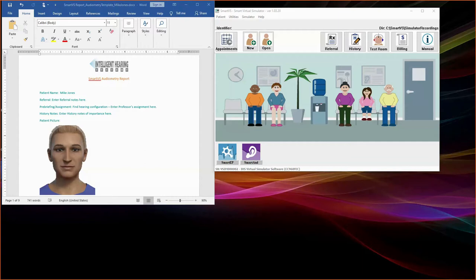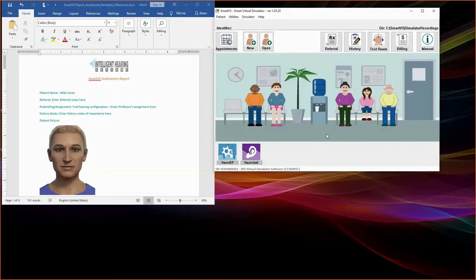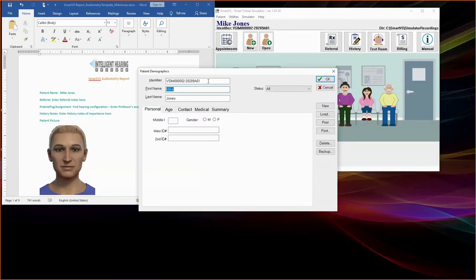In the interest of time, I have already generated my patient report. I am using Word, but you can use any other word processing or documentation program. My report is open to the side as displayed here. I have started my report by entering the patient name. To begin working in SmartVS, select Appointments, highlight Mike Jones, and click Open Patient. It will take a few seconds for the patient demographics to load up as the patient creates the patient folder and links it to the simulator profile. This will create a unique identifier where all of the patient's data will be stored. Click OK to finish registering the patient in our patient management database.